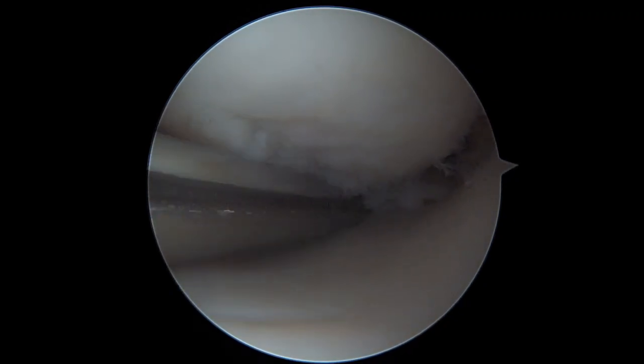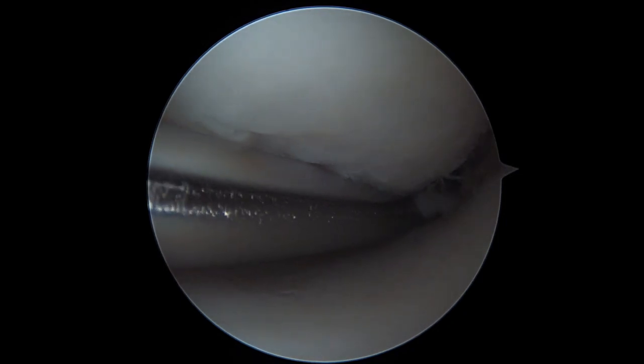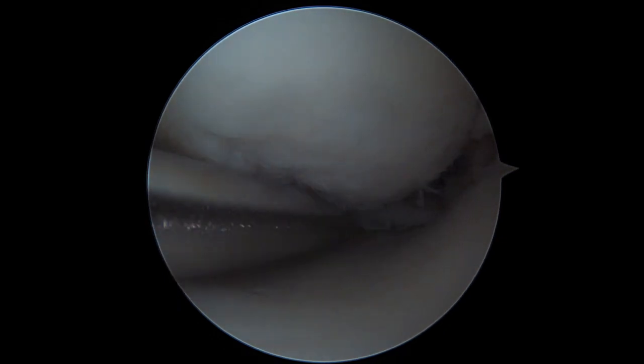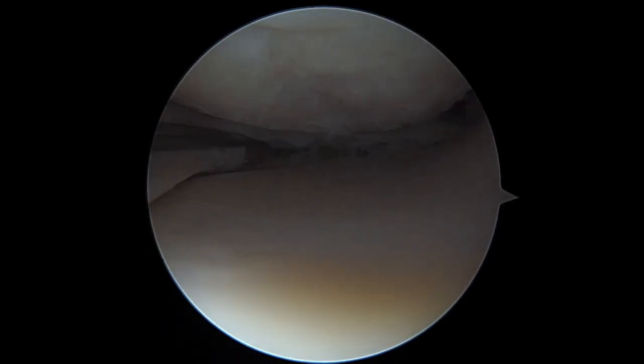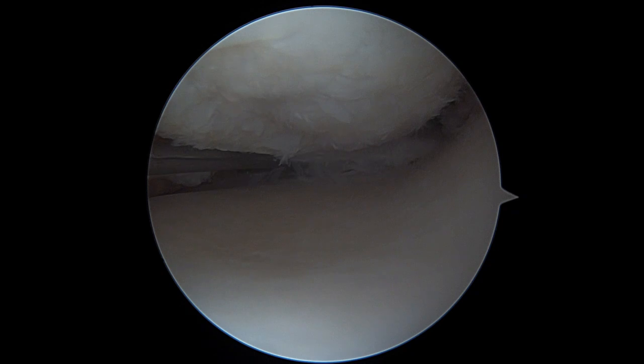In this case, our residual meniscus will necessarily have some persistent small irregularity due to the degenerative nature of these lesions and to the mild osteoarthritis context of the medial compartment. But the most important goal will be to reach stability of the posterior horn and no more unstable fragments able to produce mechanical interference between femur and tibia, as we are able to confirm by inserting once more our metallic probe in order to confirm the stability of the residual portion of the medial meniscus.